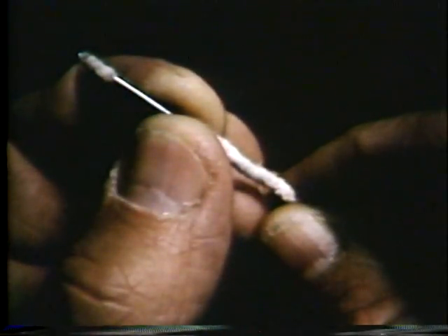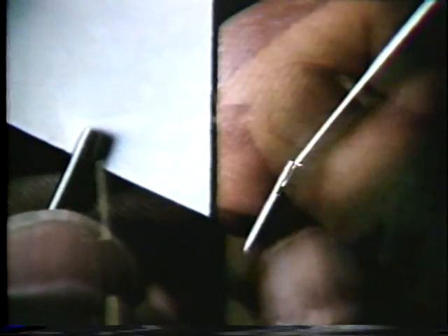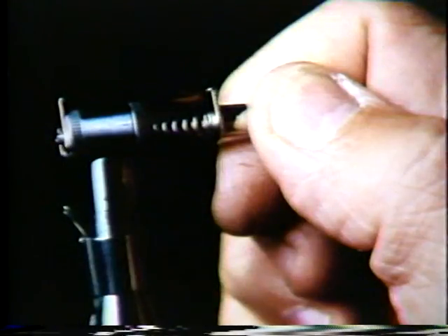After removing the chuck, run a pipe cleaner through. Run a thin piece of paper through the slits to remove that dirt. If the paper won't fit, gently spread the slits apart until the paper can slide through. After thoroughly cleaning the chuck, screw it back in with the burr tool, but don't over-tighten it.